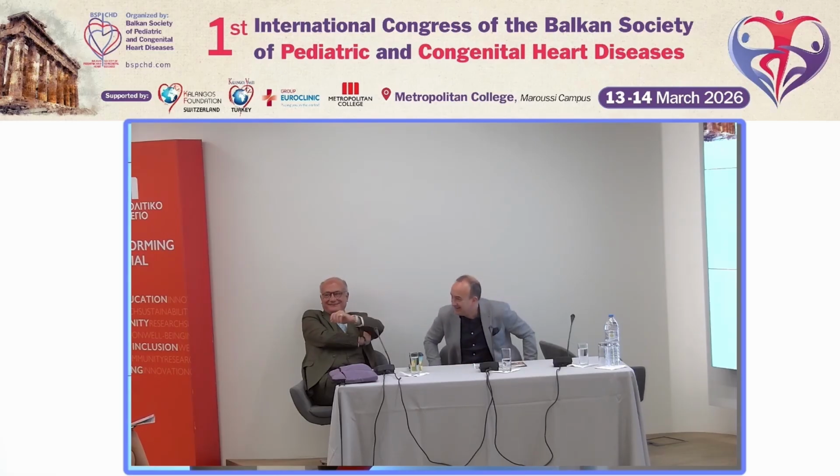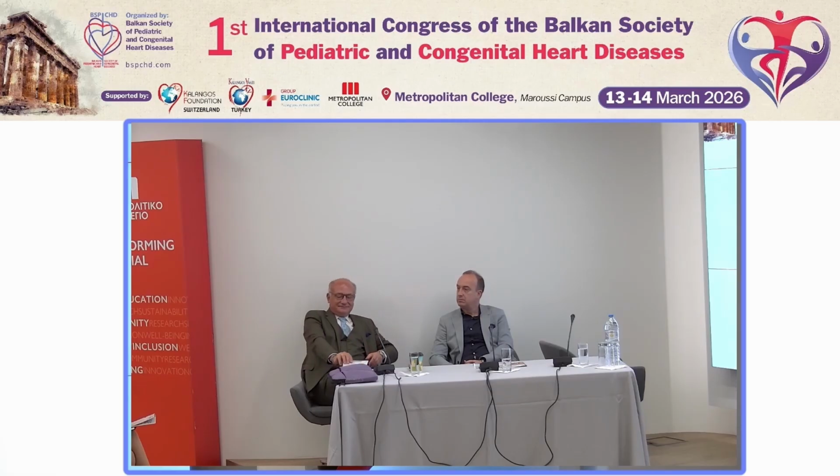That is true. So if you have a borderline case and not clear clinical symptoms, then it's better to do the MRI. Oh yeah, definitely. Yeah, that is where it really shines. If you have borderline cases, because you know, eccentric jets, multiple jets, echocardiography can be a pain with these cases. And if you don't have symptoms, this is the thing with the new guidelines, isn't it? That you have to rely on indices rather than on waiting for symptoms, because it's all about ventricular recovery.